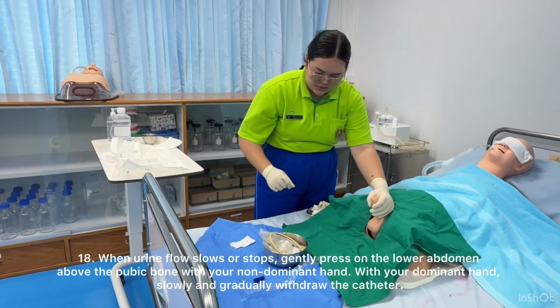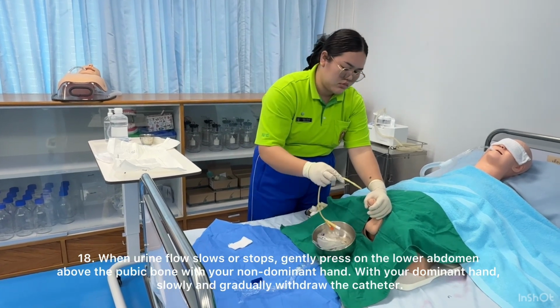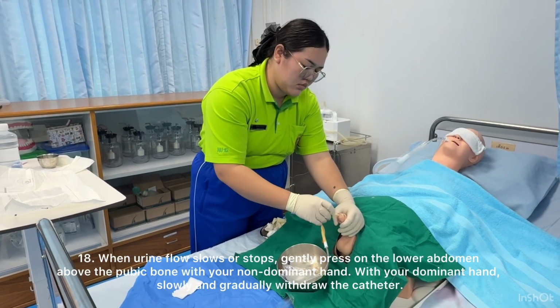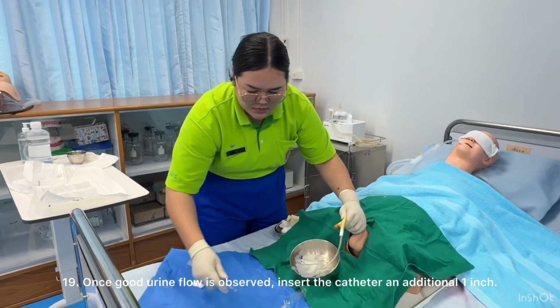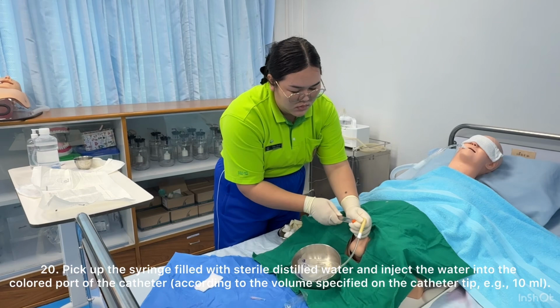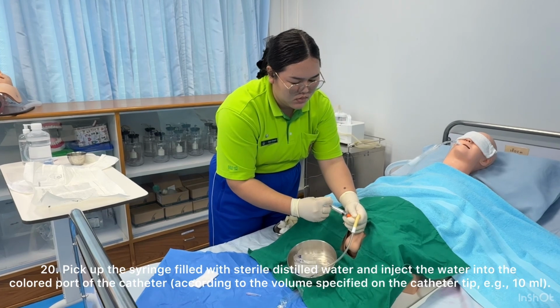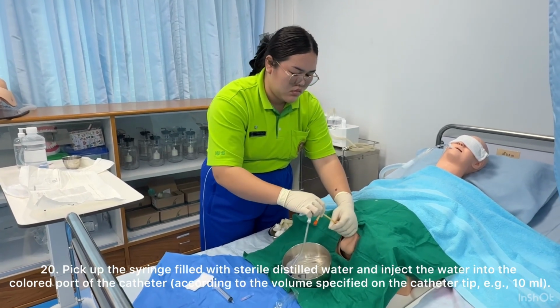18. When urine flow slows or stops, gently press on the lower abdomen above the pubic bone with your non-dominant hand. With your dominant hand, slowly and gradually withdraw the catheter. 19. Once good urine flow is observed, insert the catheter an additional 1 inch. 20. Pick up the syringe filled with sterile distilled water and inject the water into the colored port of the catheter, according to the volume specified on the catheter tip, e.g., 10 milliliters.